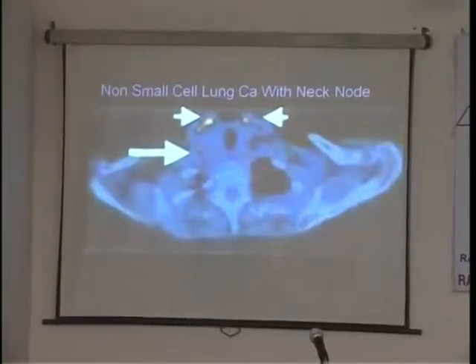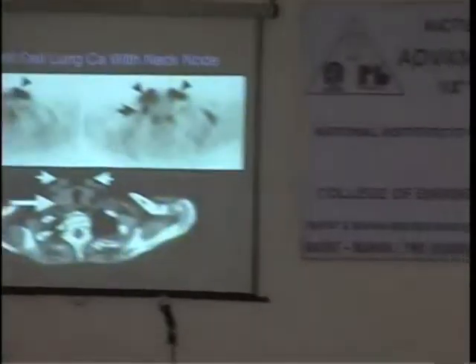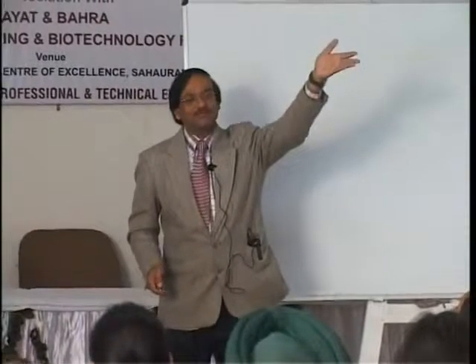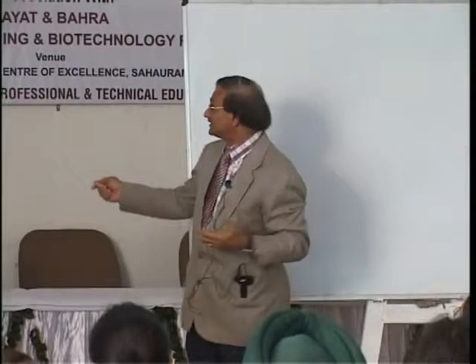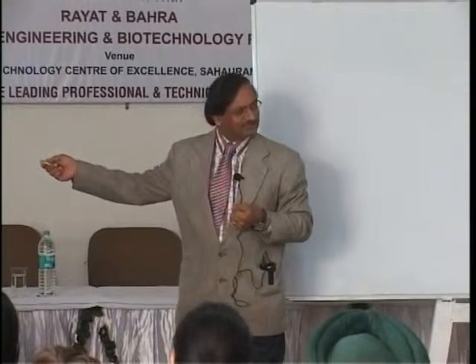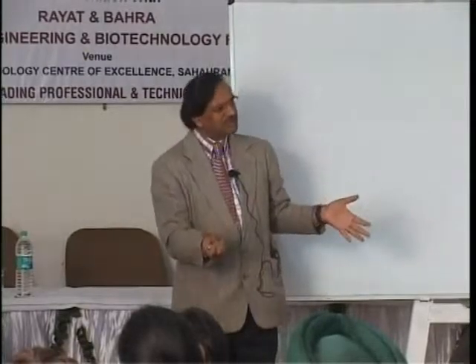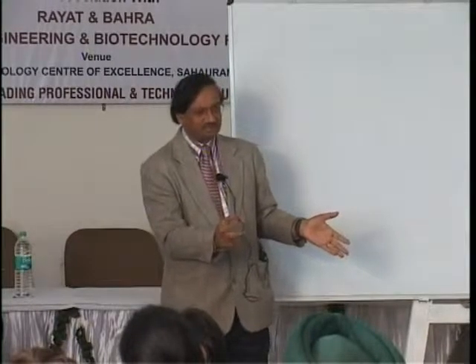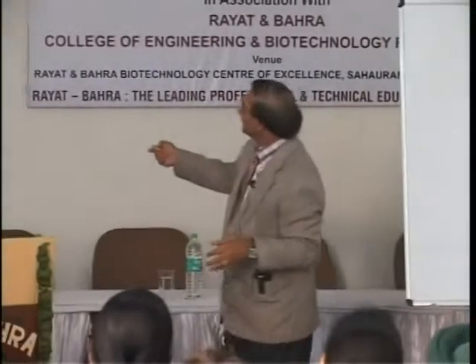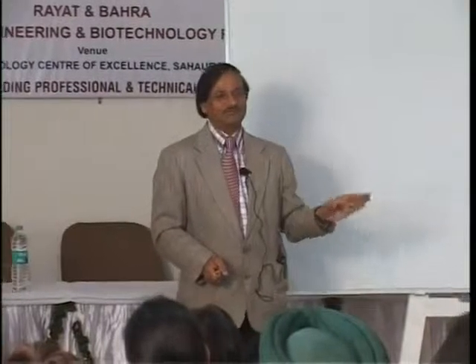But if you go back to the old days, if you try to read in isolation in one corner, say PET is situated in the next building, College of Law, and there is a diagnostician sitting there trying to read these images, they say it's all abnormal. Go and have surgery here. When somebody is sitting here, they say, oh, these are all muscle. Looks like muscle, maybe there's something. But when somebody is sitting at an intelligent workstation, he understands these are all normal.